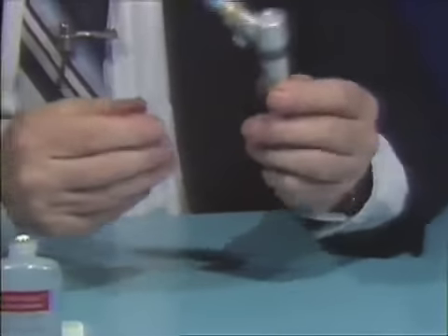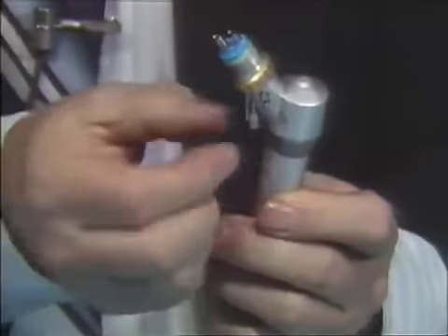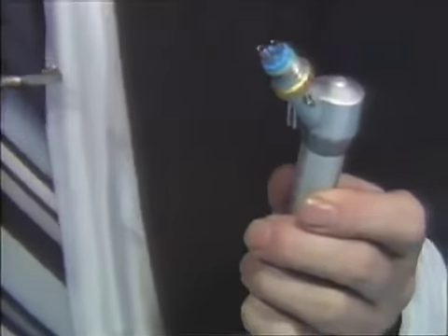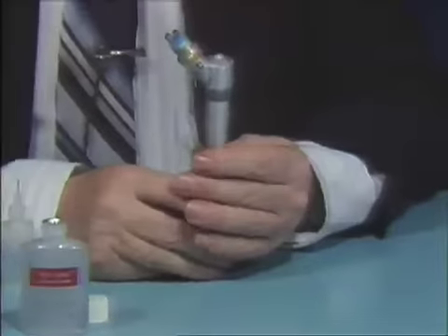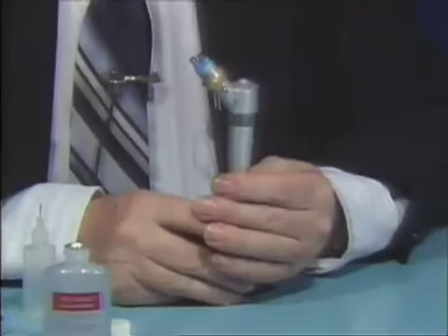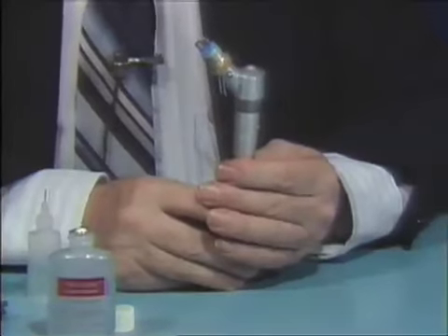Also, you received plastic plugs — remove the plastic plugs from the handpiece, and there are two more inside the shipping box. Discard them all. When you are ready to sterilize this handpiece, lubricate it and run it before sterilization, and lubricate it and run it after sterilization. That is very important.